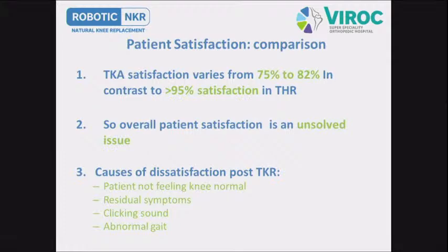We are changing the joint line orientation. So this is the other change which we are doing in mechanical alignment. We are altering patellofemoral biomechanics. So we are overstuffing the distal lateral femoral condyle, leading to abnormal lateral retinacular stretching. So that is why we do lateral retinacular release, this we have installed. And this is causing abnormal patellofemoral biomechanics. So, though equal flexion and extension gap is the goal of mechanical alignment, this is not as per our normal anatomy. We introduce actually ligament imbalance by not aiming at the normal anatomy.